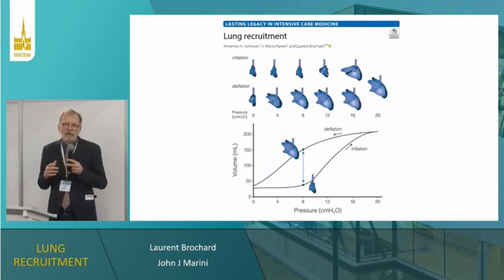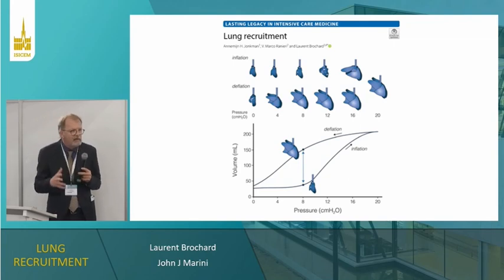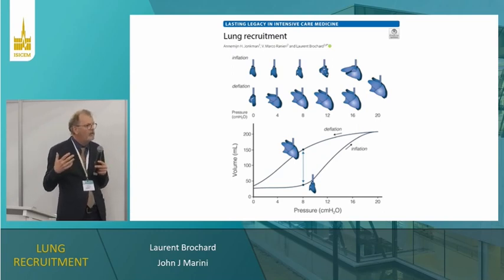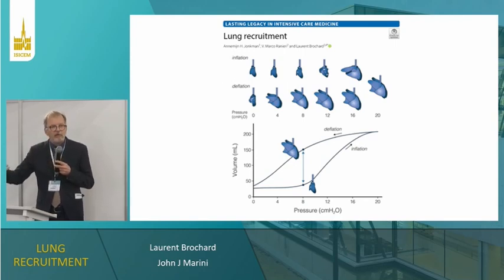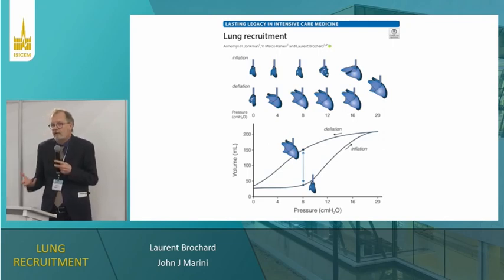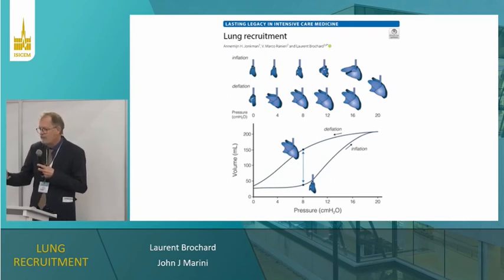And second, the more atelectasis you have, the higher it is for the right ventricle to work. Okay, so for the right ventricle and for lung volume, I think you need some PEEP. However, 6, 8 centimeters of water may be okay. And the next question as a clinician is the rest of the lung recruitable, so I should try to increase the PEEP? That's my clinical question at the bedside, right? Should I put more than the 8 centimeters of water?